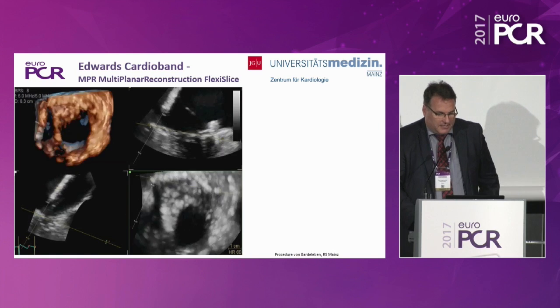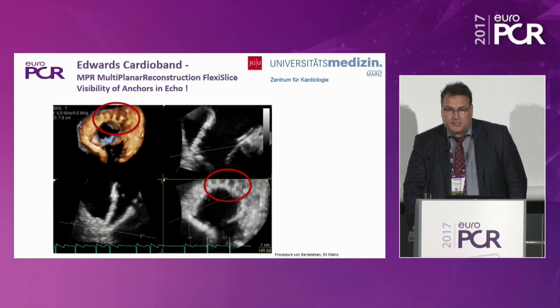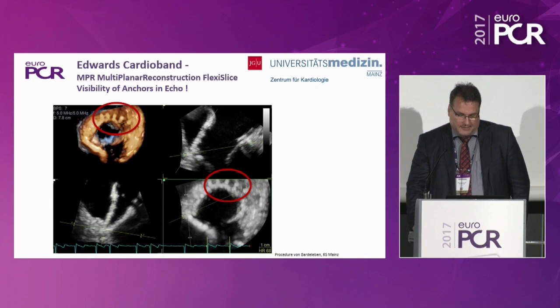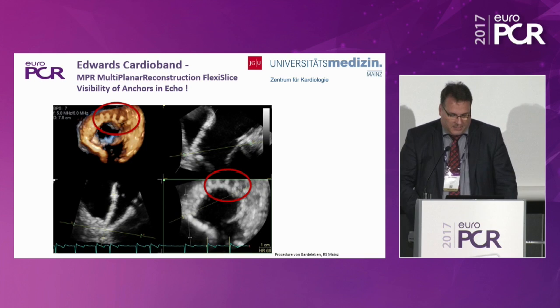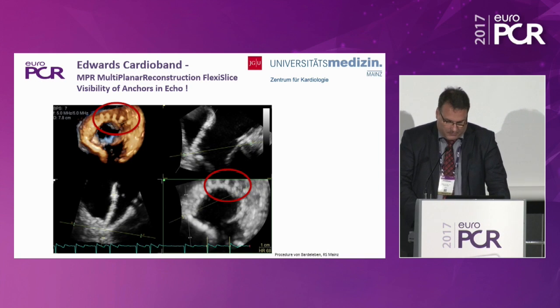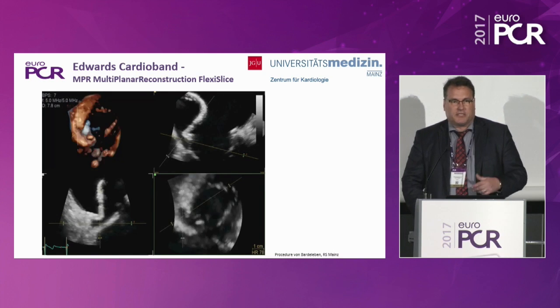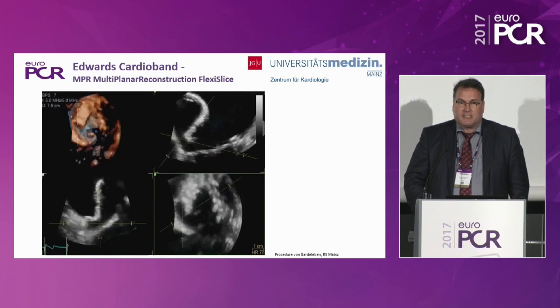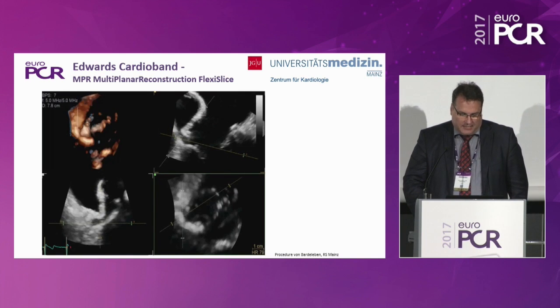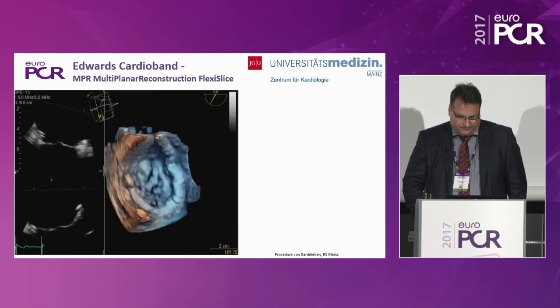This is also depicted here, but what you can also see is that we're able to see the metal anchors in the annulus themselves. So you can see the angulation and the angles in both the 3-dimensional data set as well as in the derived 2-dimensional cut plane, which are simultaneous recordings. This is then done until the hooking position on the septal part, where you have to invert the catheter to come back 360 degrees in order to finalize the implants at the site of the medial hinge point.